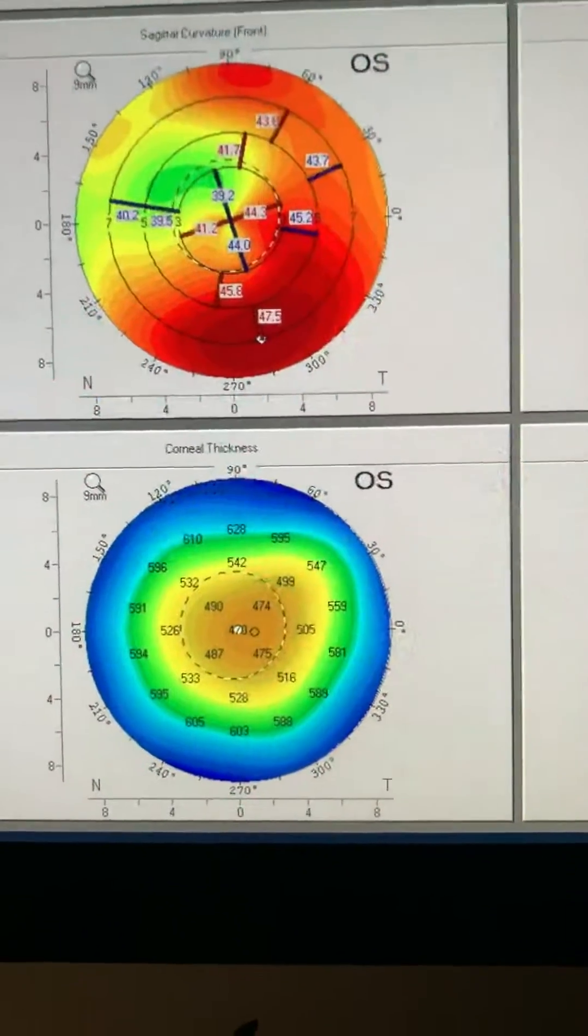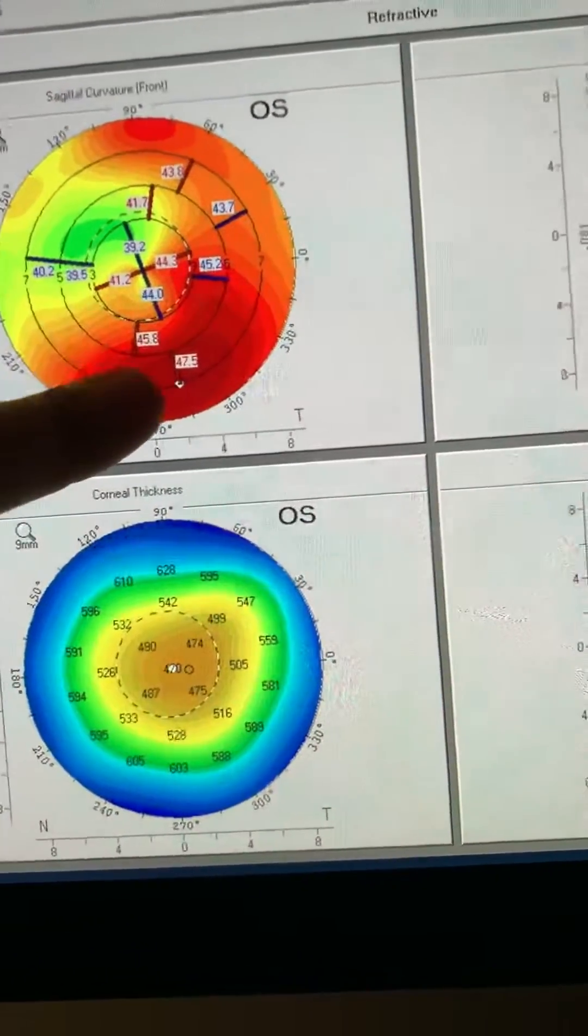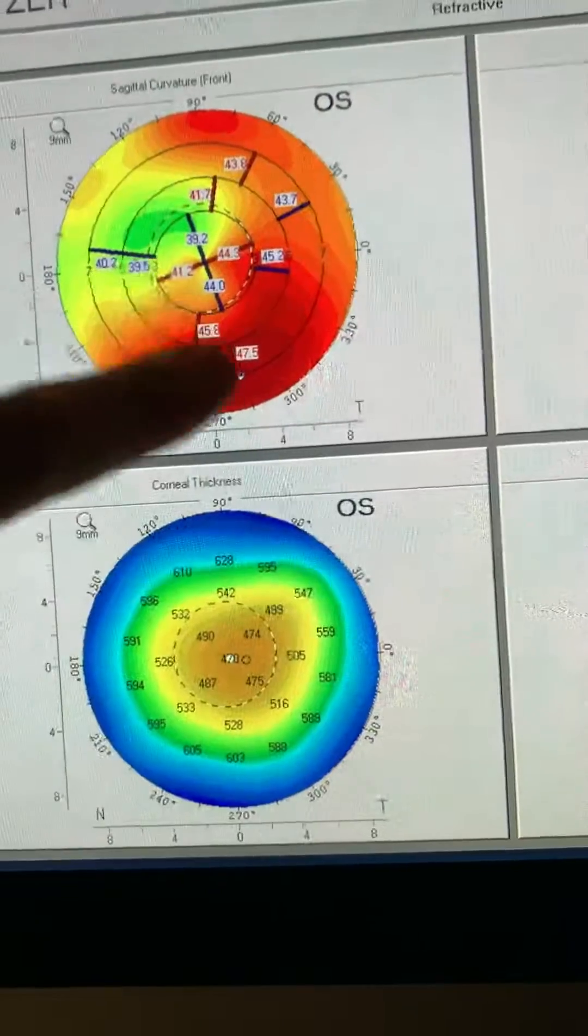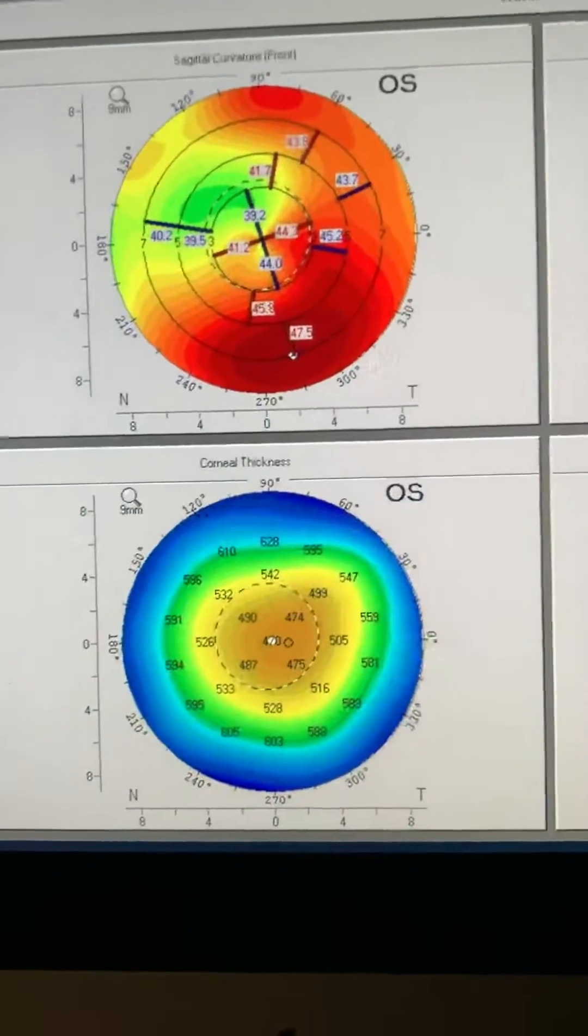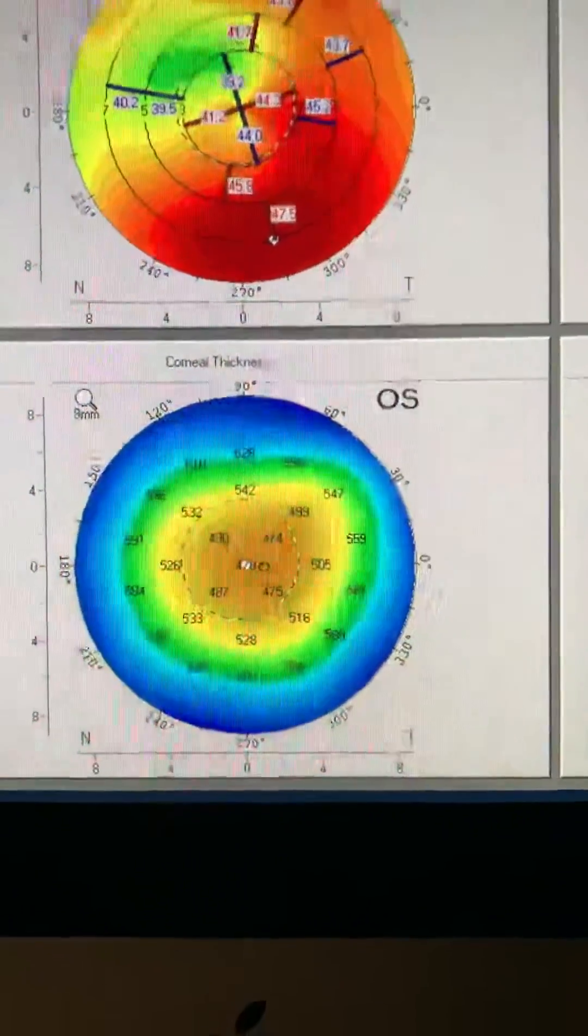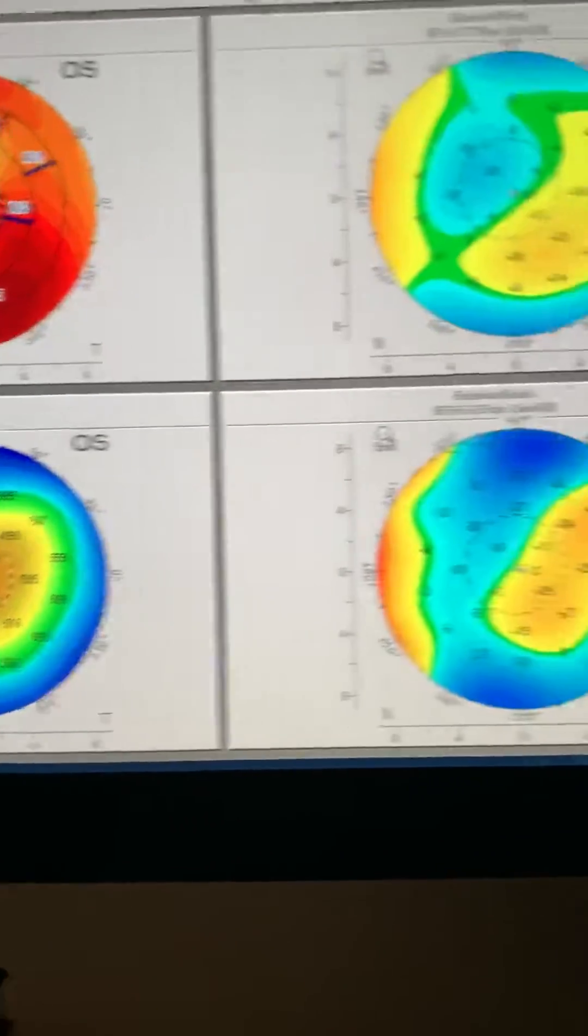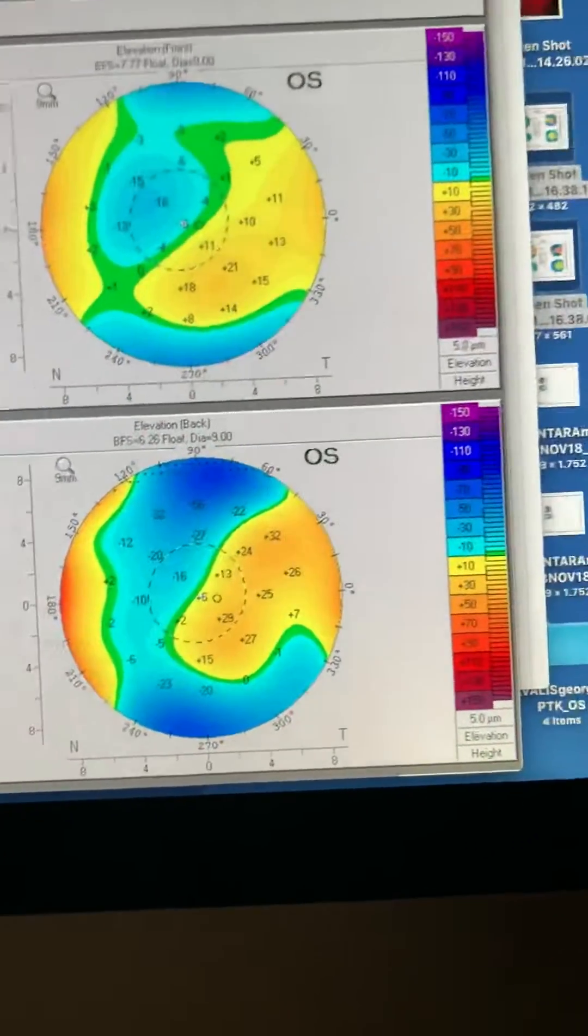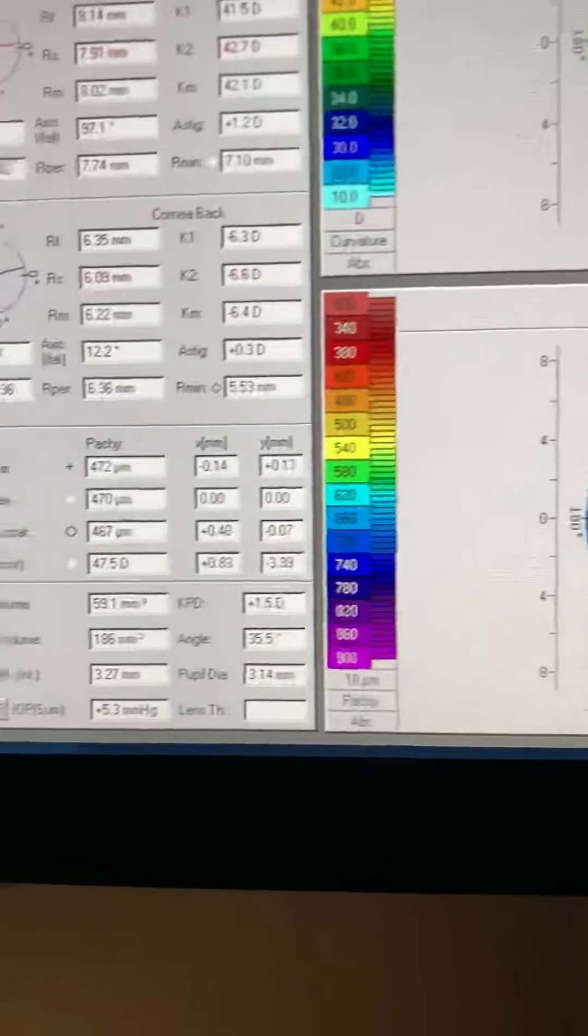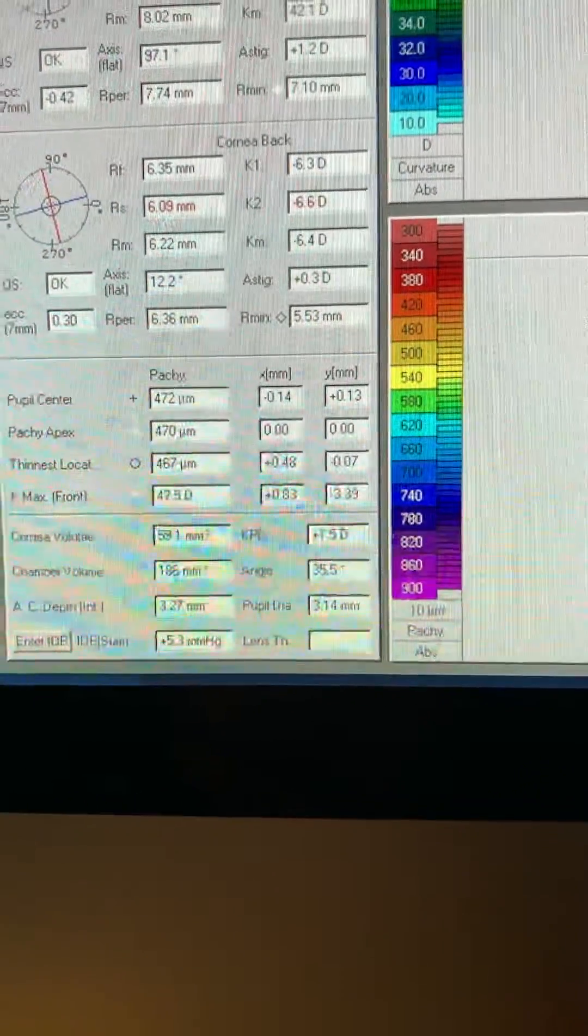This is the other eye. We can't say that this is a quiet eye after LASIK. There is some inferior steepening developing here. Of course, we're going to watch this closely. We can also see the changes in the posterior float. But nevertheless, the residual cornea thickness is 467.